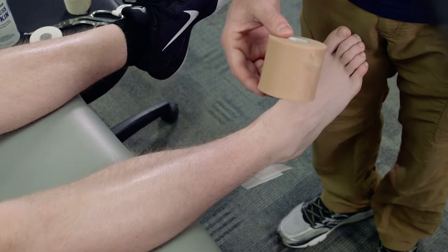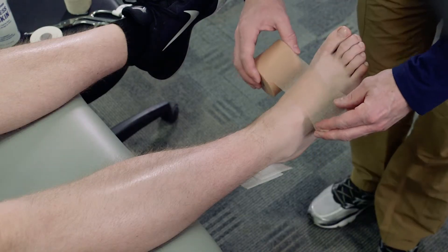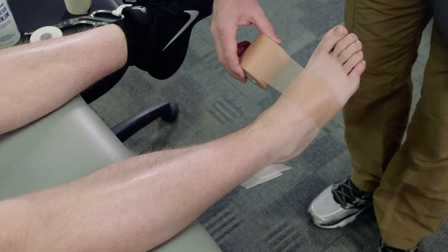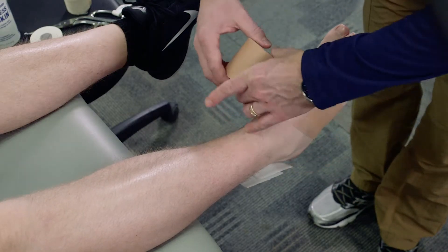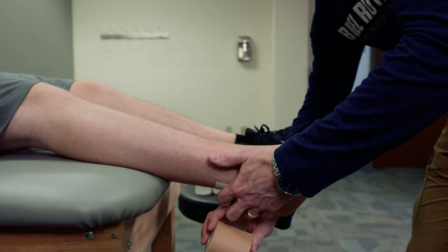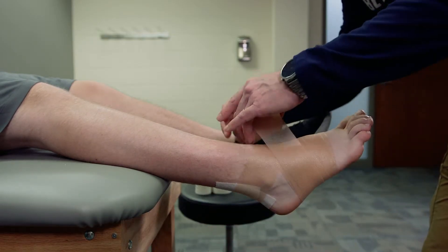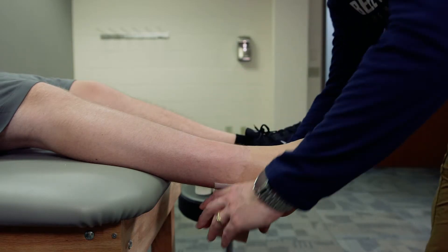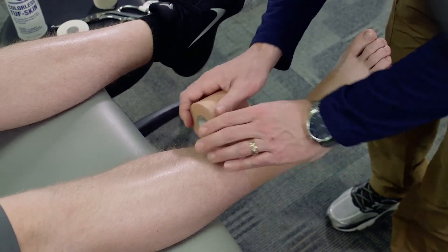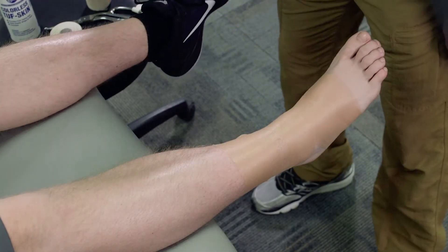We're going to take our pre-wrap, just like with ankle taping, and secure it around the foot first, making sure there are no wrinkles. We'll go around the foot a couple of times, then do a figure eight pattern to secure those heel and lace pads into place and back around the foot. We'll repeat that pattern as we move up along the foot to almost the base of the calf, securing it down with no wrinkles.